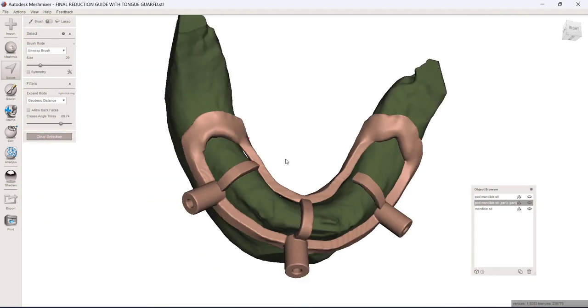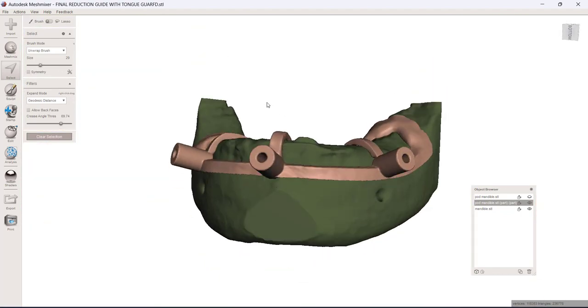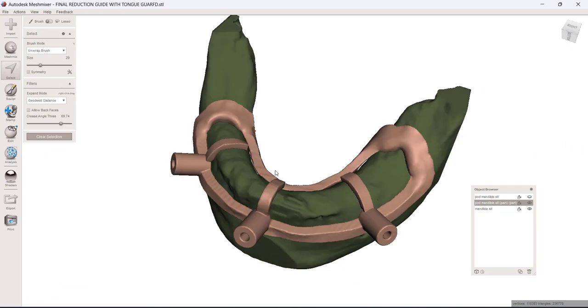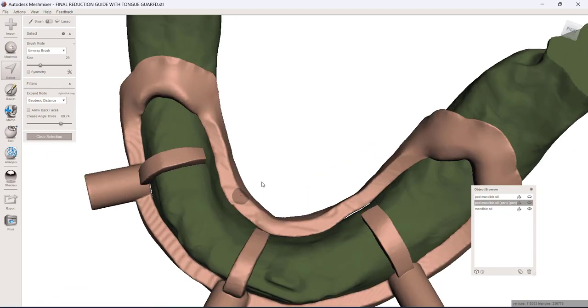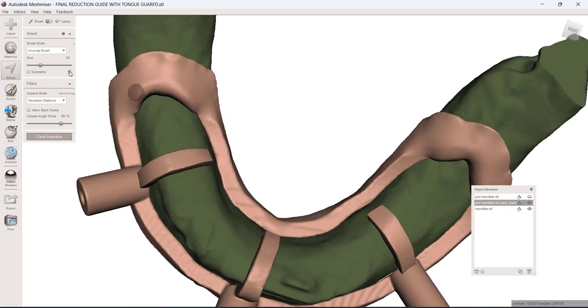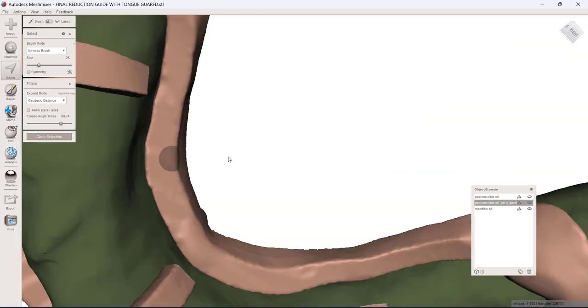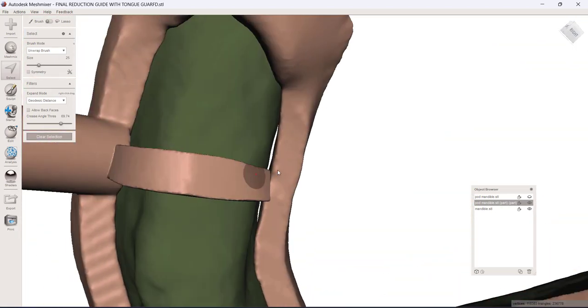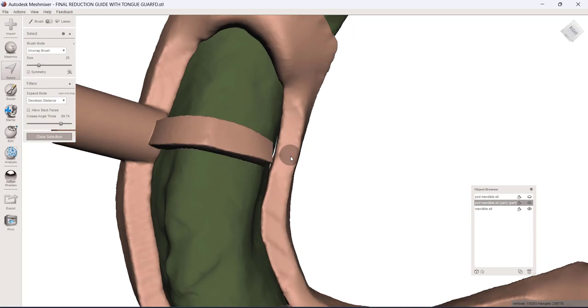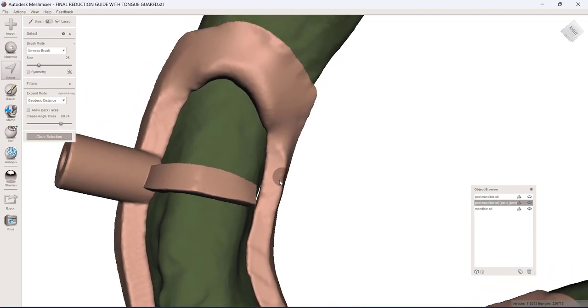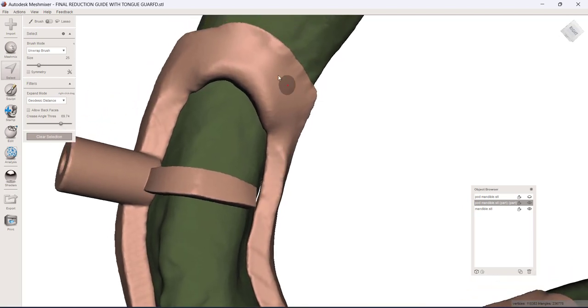So I'm going to get, I'm in Mesh Mixer right now. This has all been designed previously in Blue Sky, but I'm going to get a relatively small spot size, maybe like 25 or so. And what I'm going to do is just build in an area on the lingual of this guide that is going to be used for retracting the tissue.